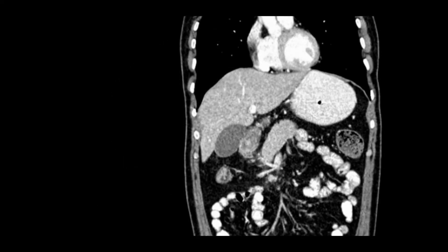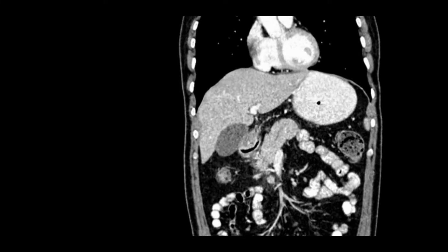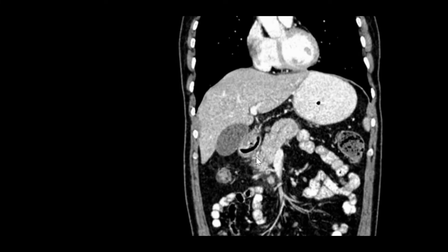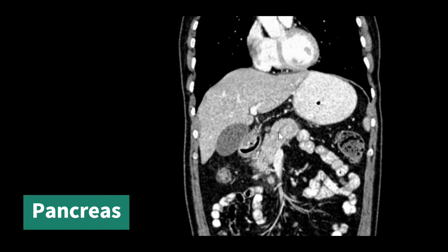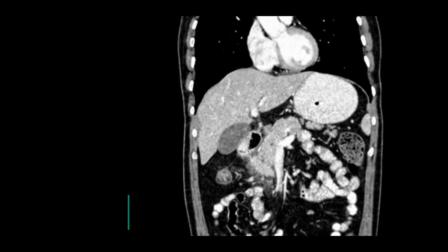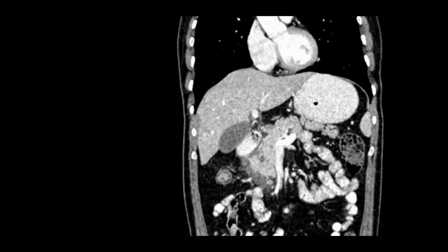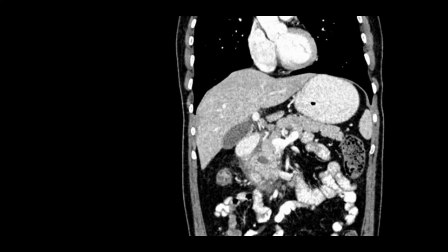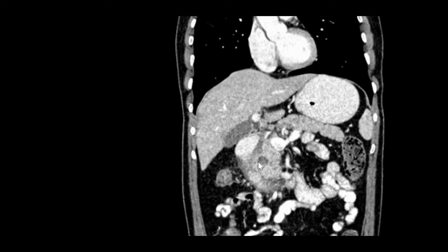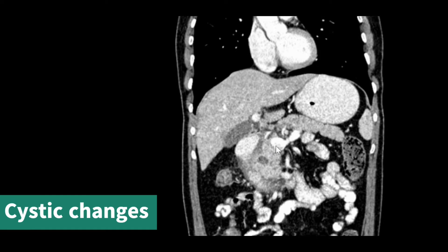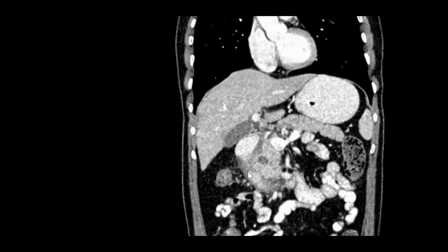This opacity in the pancreaticoduodenal groove is best seen on coronal images. Here we see the head of the pancreas and the rest of the pancreas with the main pancreatic duct. Going back, we can see those cystic changes which I showed in the axial sections — this is the head of the pancreas and this is the second part of the duodenum.